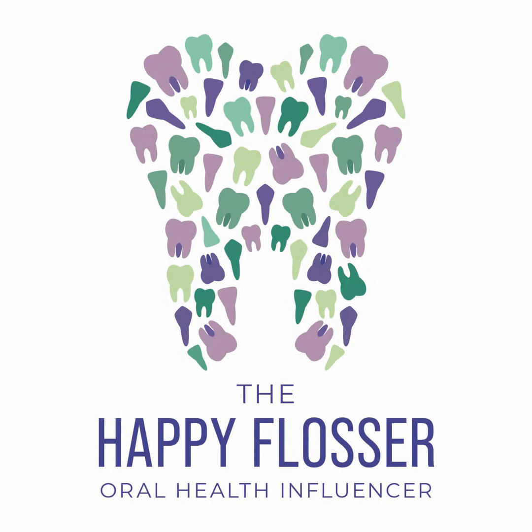And then speaking of bone loss percentage, if you are looking at the horizontal bone loss on a full mouth series of x-rays and you just say that the bone loss is generalized, but you do not document an indication of percentage, you're really not telling the true story, or the next clinician who will be seeing that patient, really the definite assessment of that radiographic interpretation that you've done. So if there is generalized horizontal bone loss, be sure that you note a percentage of that generalized horizontal bone loss when you note it in the chart.